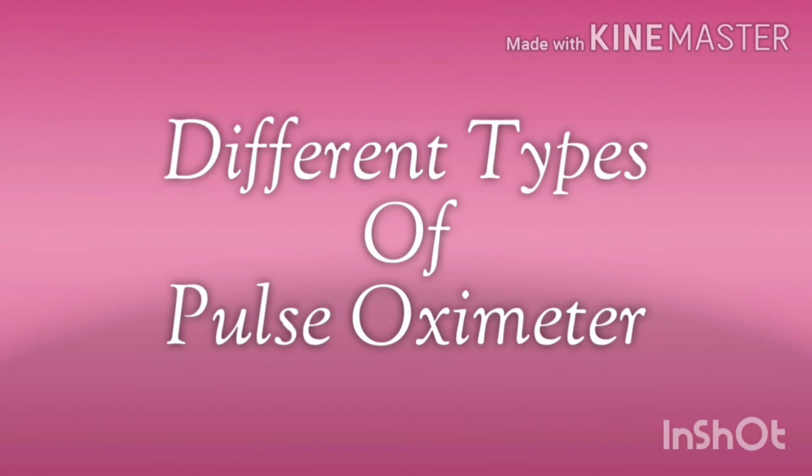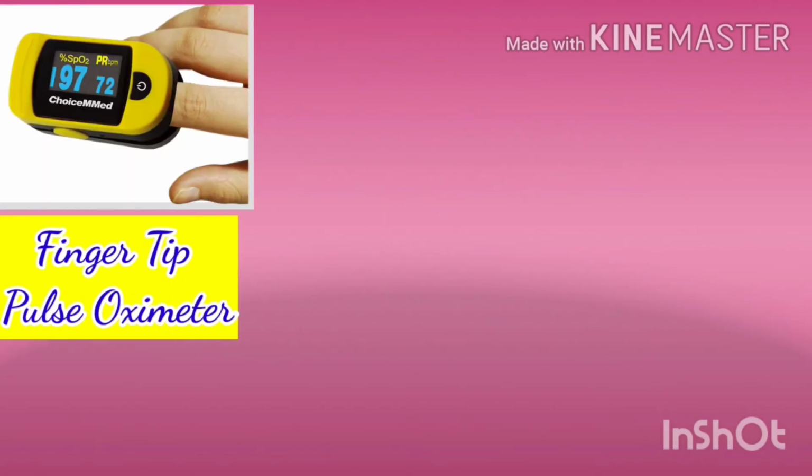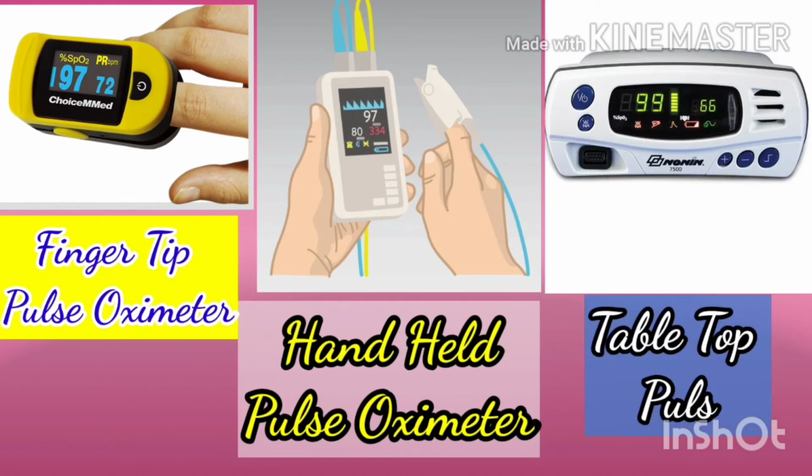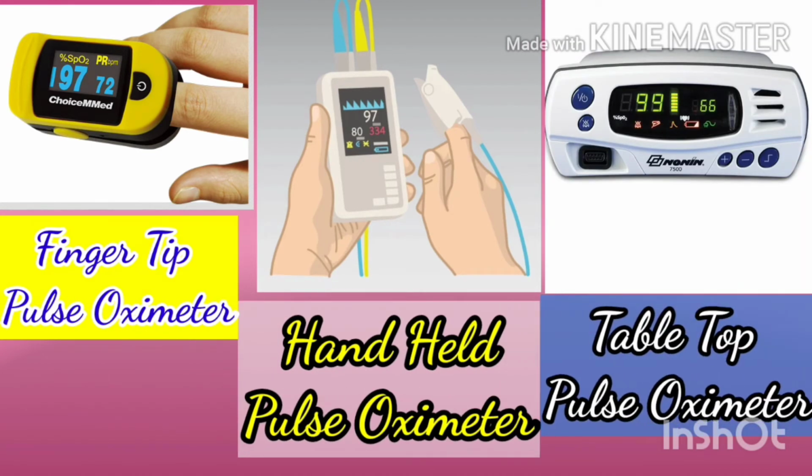There are different types of pulse oximeter, like fingertip pulse oximeter, handheld pulse oximeter, and tabletop pulse oximeter. Fingertip pulse oximeter is generally used at home, and handheld pulse oximeter as well as tabletop pulse oximeter are used in hospitals. How do we use the pulse oximeter?